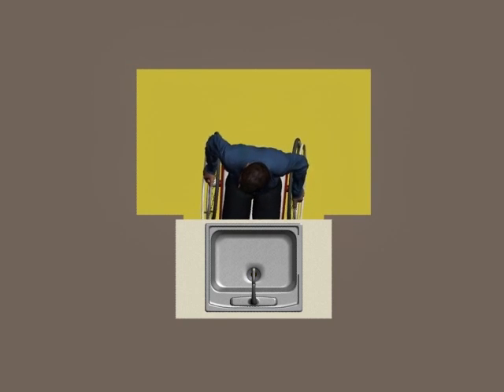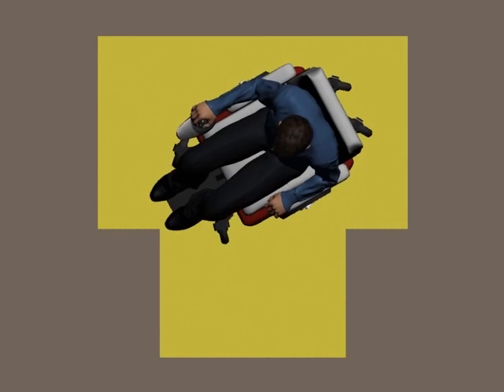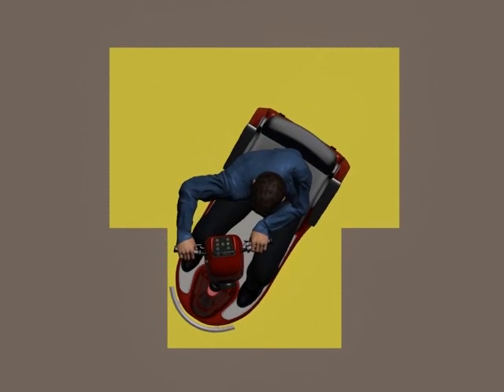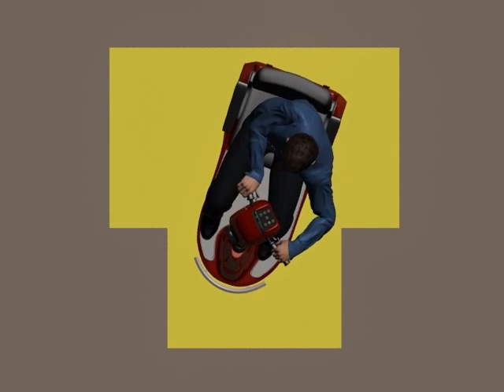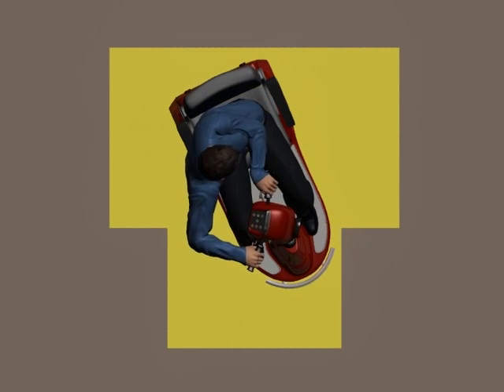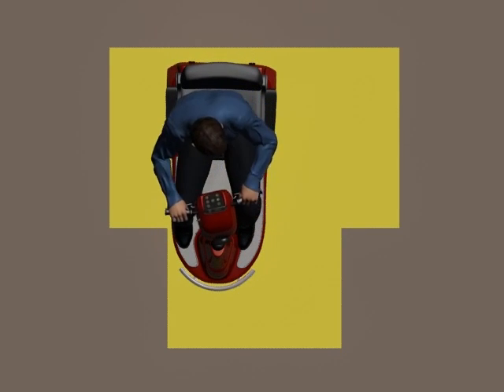Objects with knee and toe space can overlap only one segment of the T so that the other two remain clear for approach and backing up. Turning within the minimum dimensions specified can be difficult using scooters and similar devices that have a larger turning radius. The availability of additional space beyond the minimum required will ease maneuvering. Also, avoiding overlap of the space by an object will better accommodate devices with front tillers.